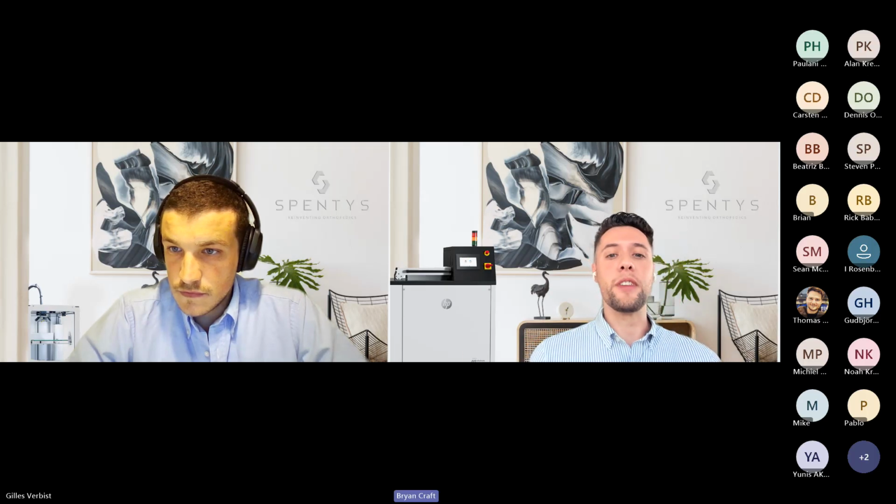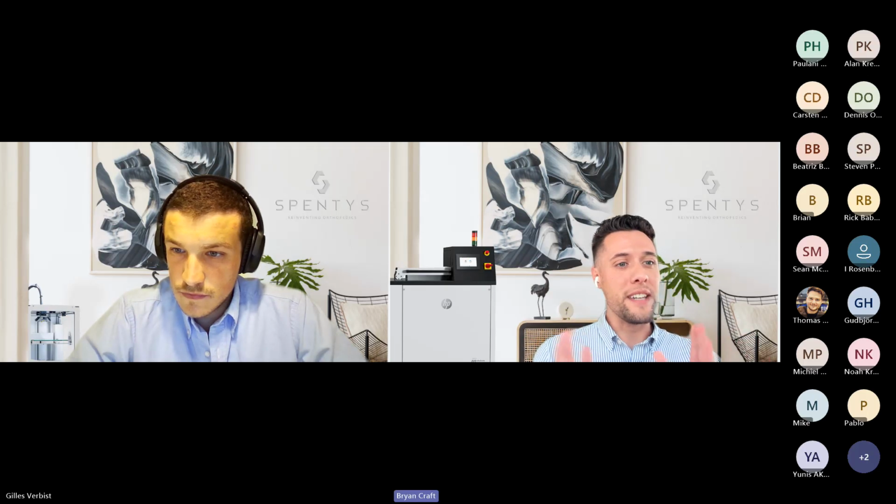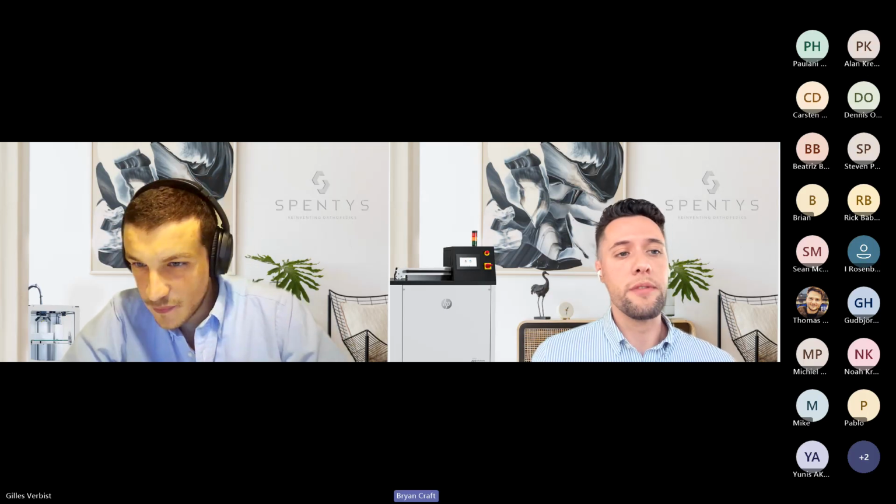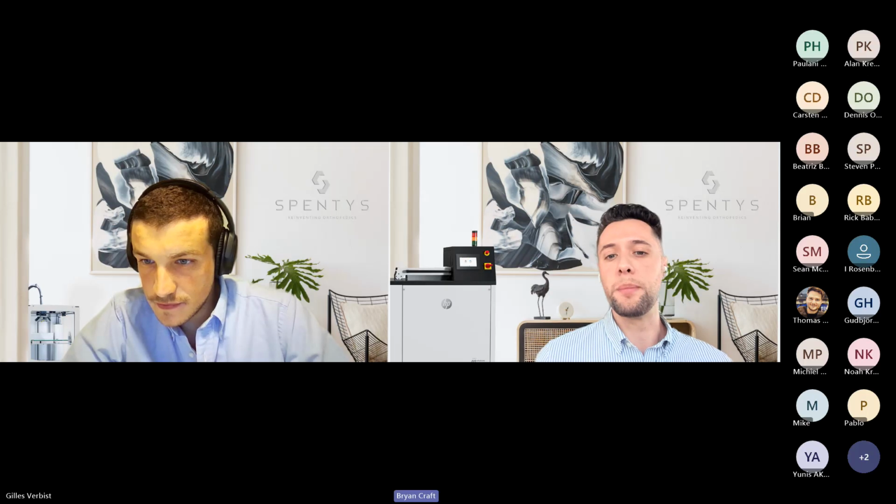Well, this is not a webinar for that difference, but you can always take screenshots of that measurement validation step. You could always superimpose the original to the modified, but this is a great question for some extra thinking on, Alan, what you think a better or a more robust way of capturing that data would be.